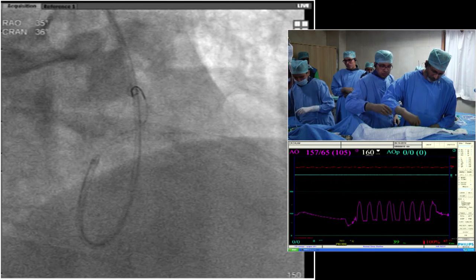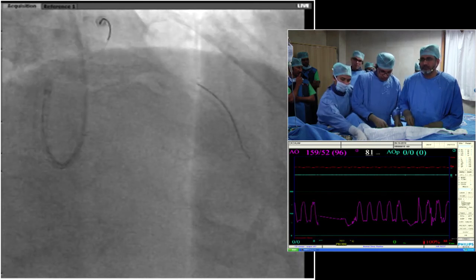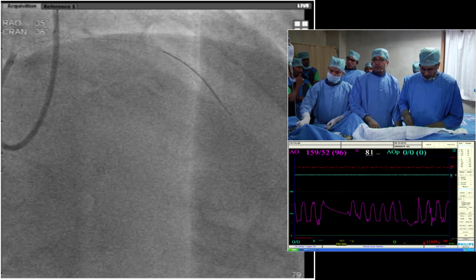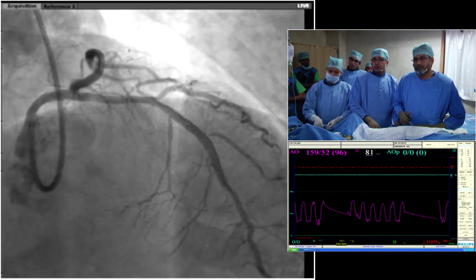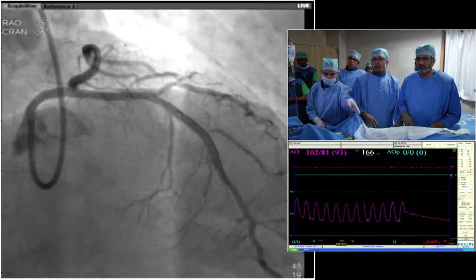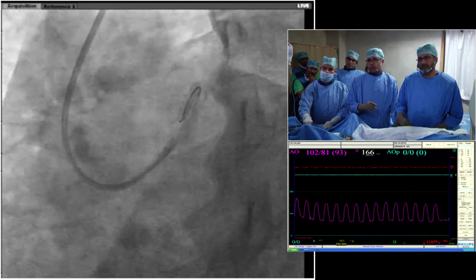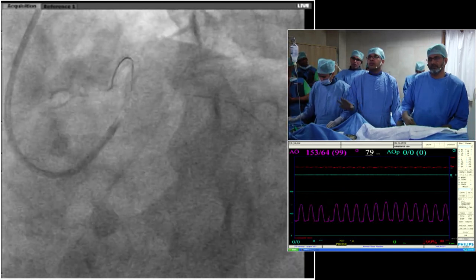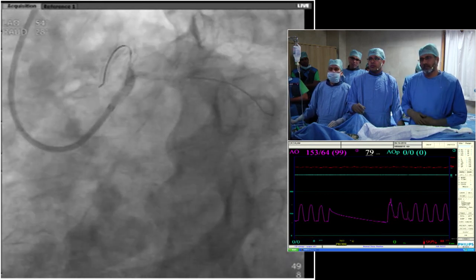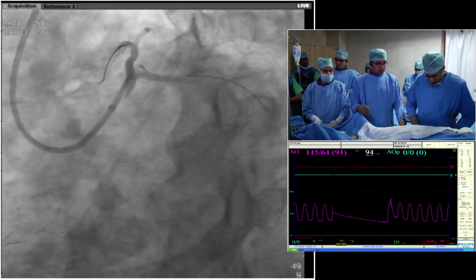As my colleague Dr. Ravi mentioned earlier, we did discuss the treatment options, both surgical and multivessel percutaneous approach. Clearly he's not a diabetic, and the patient also opted for percutaneous coronary intervention, so that's one of the rationales. Go ahead and proceed. To minimize the left main procedure related complications, we planned it in such a way to revascularize the right coronary and circumflex 48 hours prior to this procedure. As we mentioned, his creatinine is within normal limits. And OCT, yeah, we're going ahead with the OCT now.